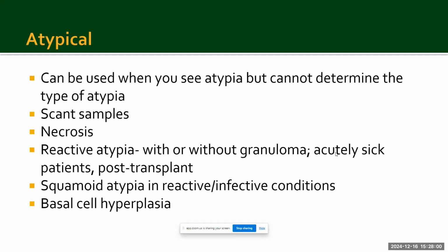Again, if you are not suspicious of a mass lesion, the patient is on a ventilator, or acutely sick with infection, or a post-transplant candidate, then I use negative for malignant cells, rare squamous cells with atypia favored to be reactive atypia, as a comment.